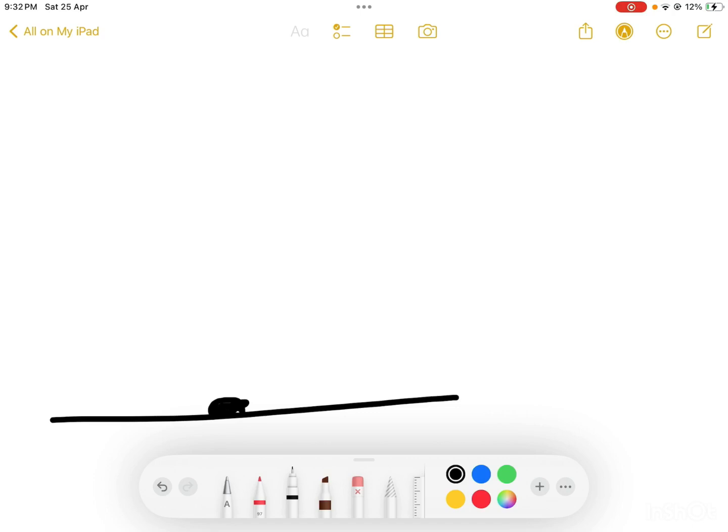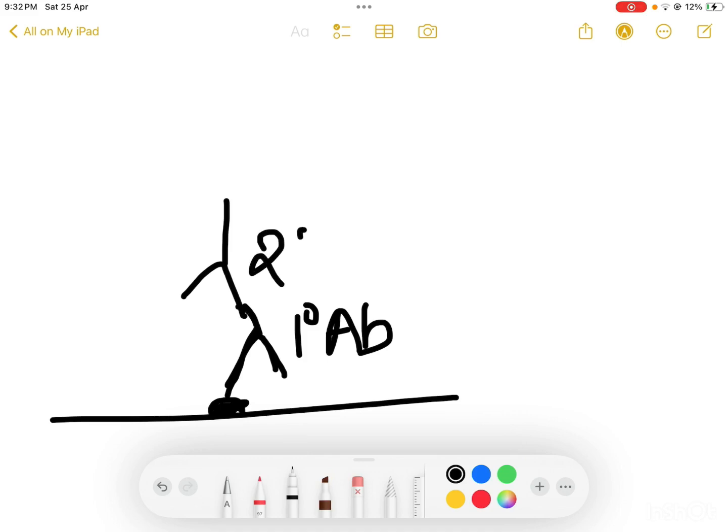So this is the protein we want to detect, so we will be giving a primary antibody against it. Okay, primary antibody against it, and against that you will be giving another secondary antibody. Now the secondary antibody is against the primary antibody. Can we get an antibody against an antibody? Obviously, antibodies are also proteins, same as the antigens. So for any bodily protein we can get an antibody. Since an antibody itself is a protein, you can get an antibody against an antibody also.